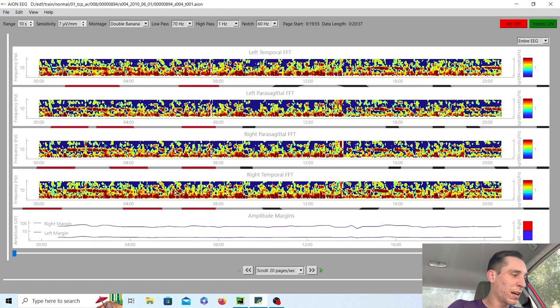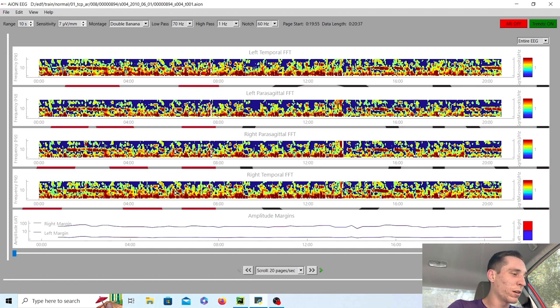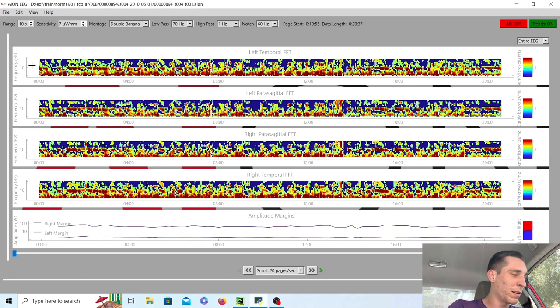Well, why did it kind of disappear here? Well, as we looked at before, the patient's eyes were open and when they closed them again, the nice red stripe at 10 or nine waves per second appears.